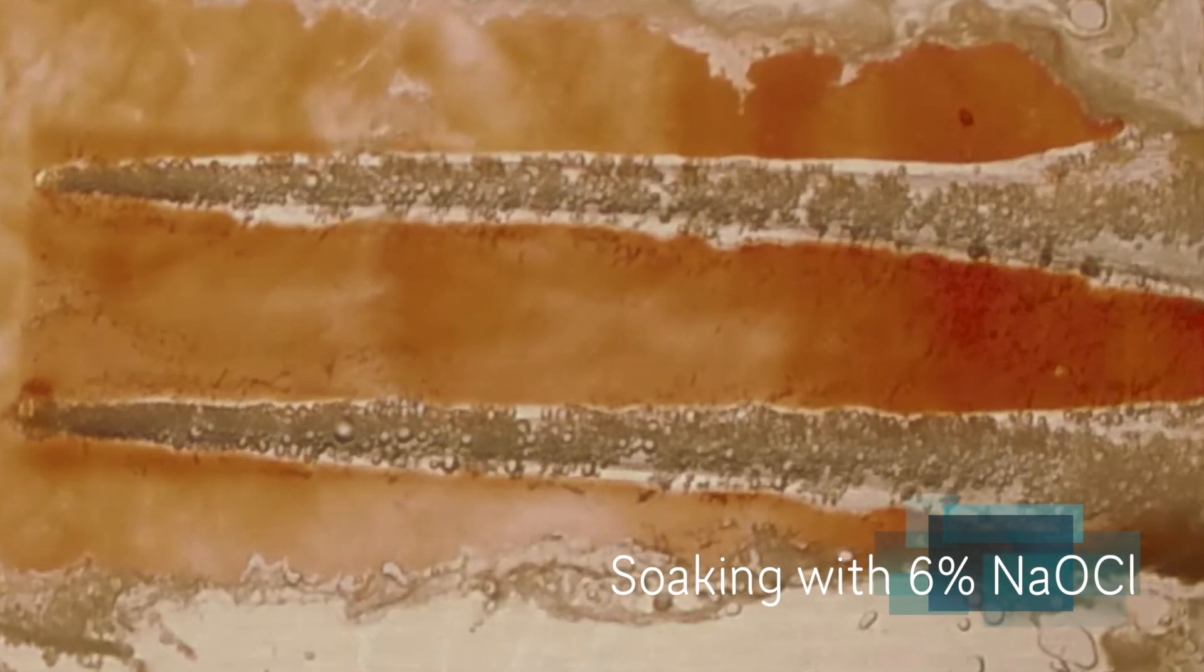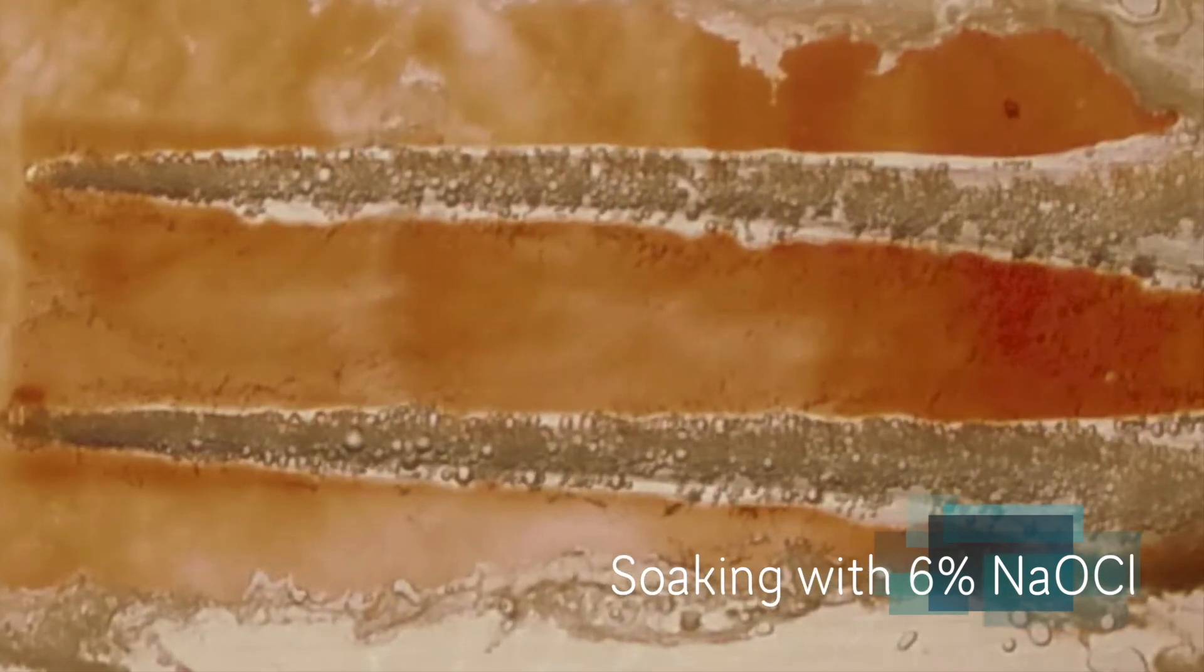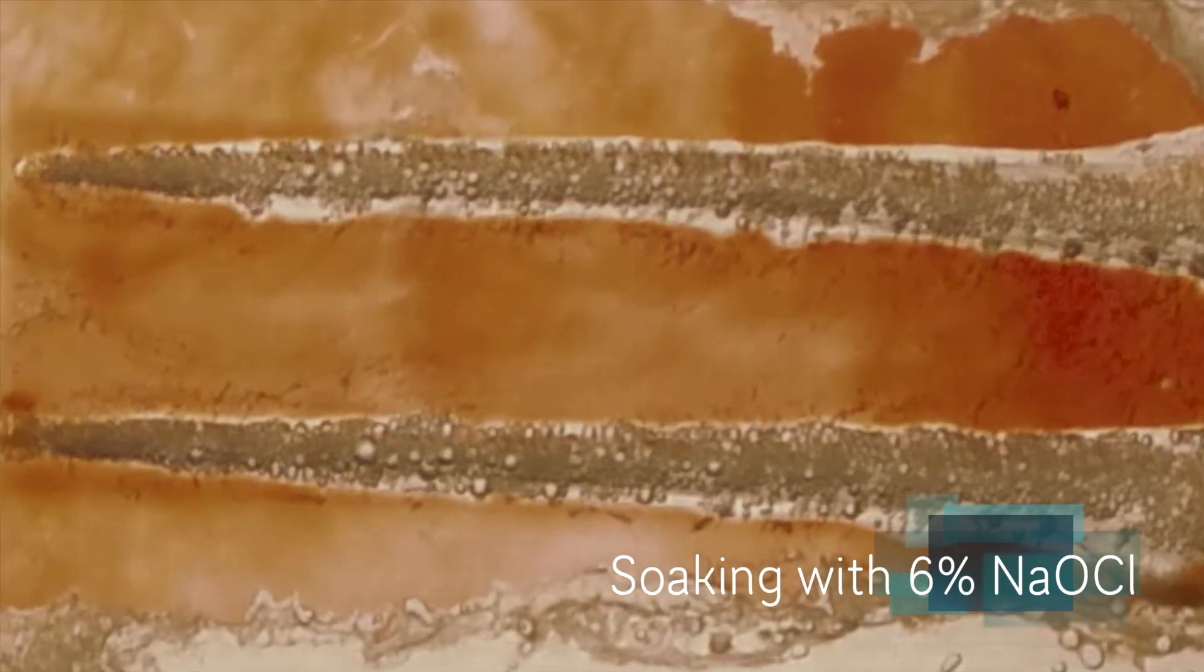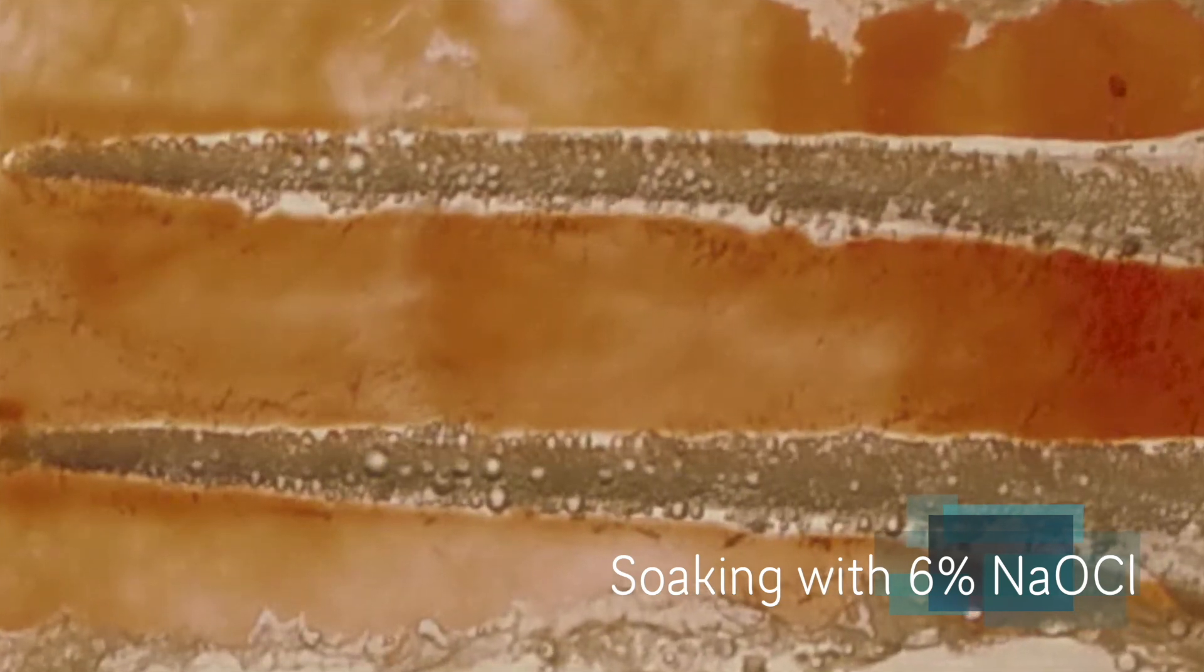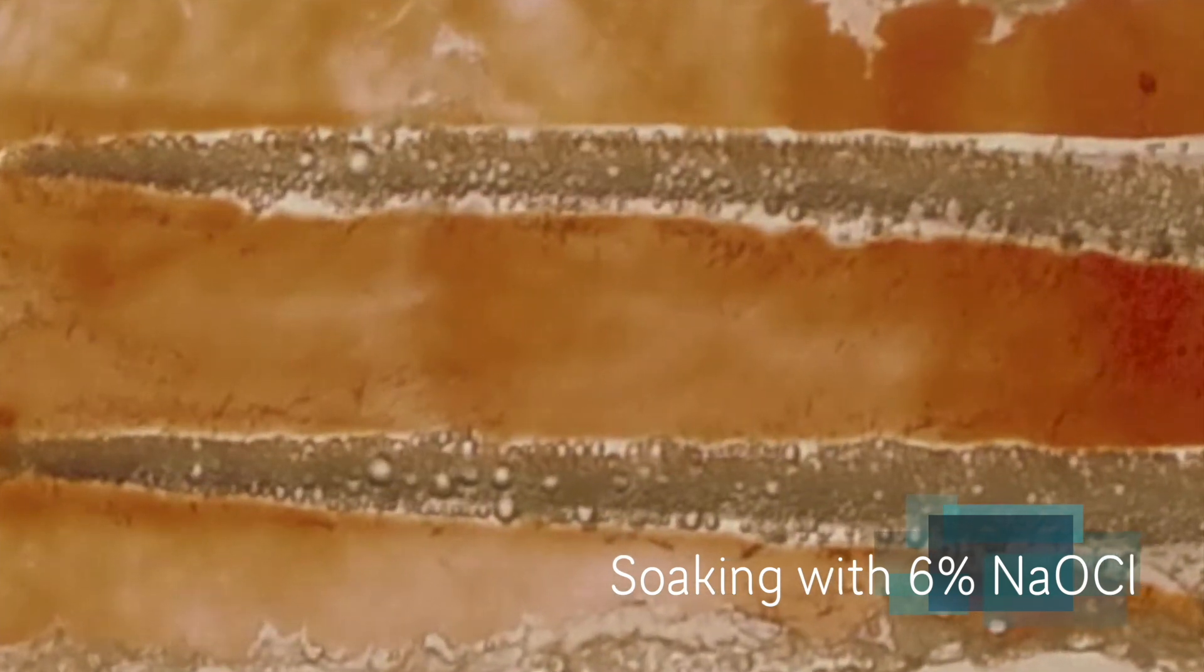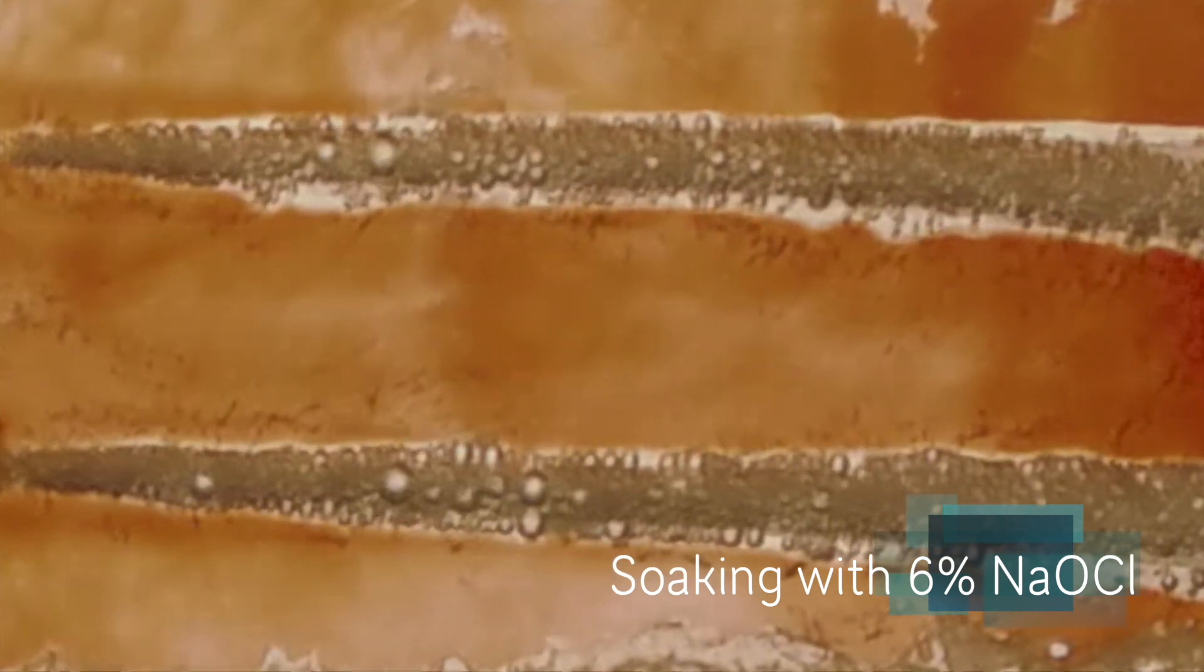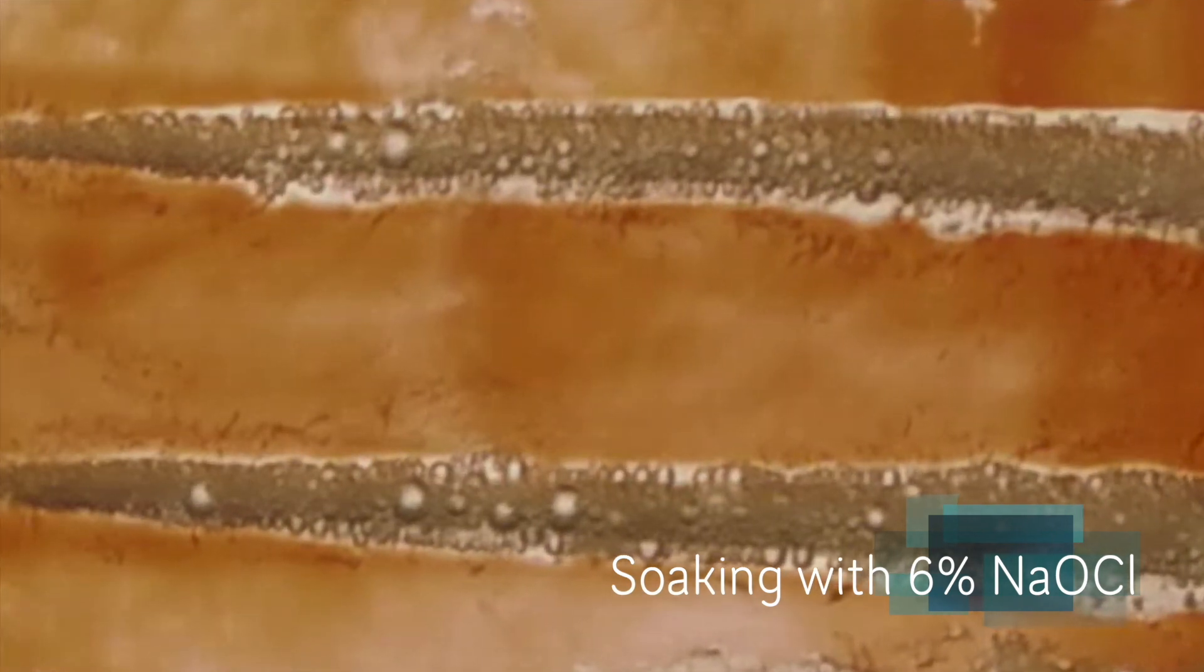I love watching it. It's kind of relaxing. In Sweden, they have these TV channels of people knitting and showing outdoor scenes that you think are a photo until a bird flies across. Well, I'd enter this in the competition for relaxation for endodontists. Cracks me up. But look at that.